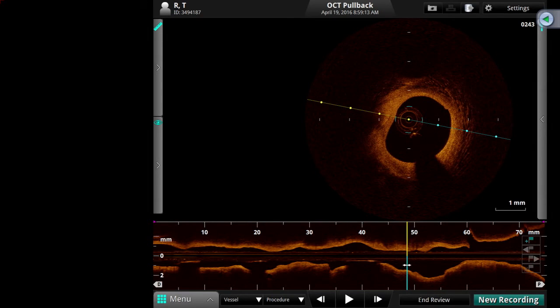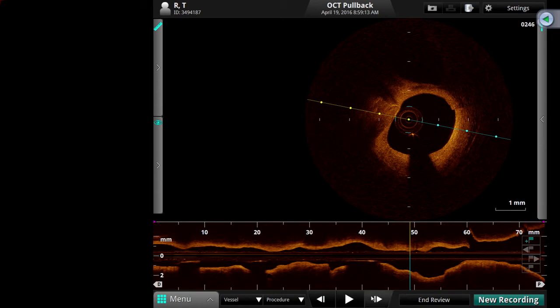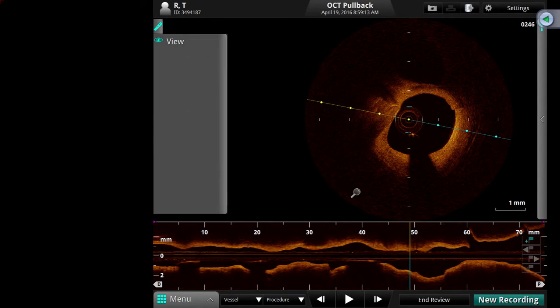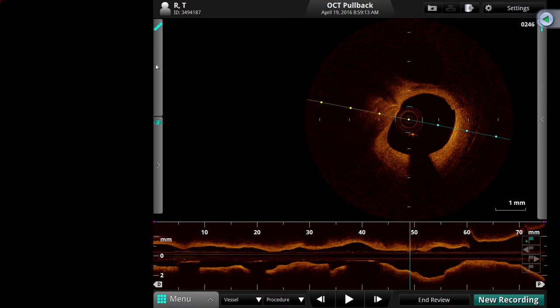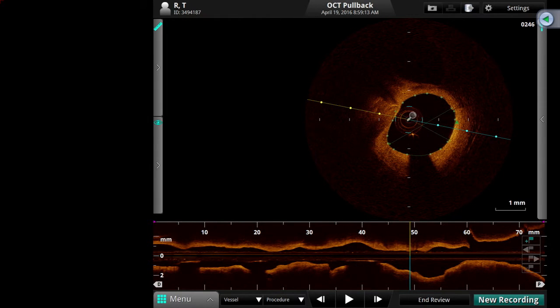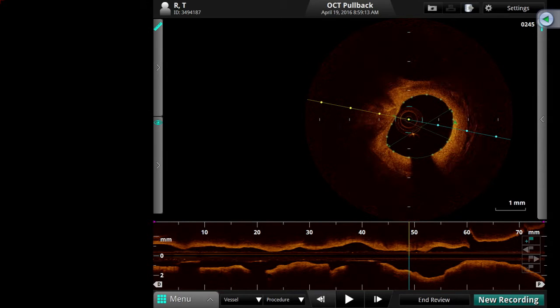Is there an ostial lesion at the side branch? You do not see the ostial lesion here. Most of it is calcium. What about the lipid arc? The whole question is about the lipid content and lipid arc. It is not lipid — it is a lot of fibrous. Calcium and fibrous. Based on this — no wire, stent across.